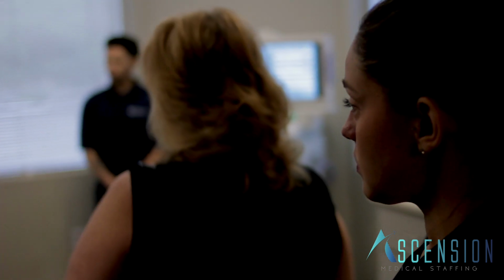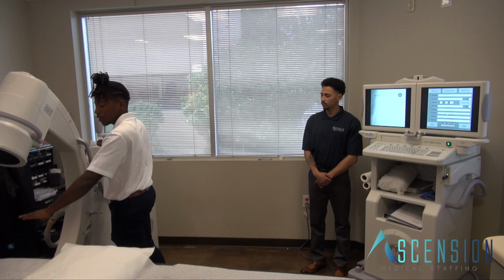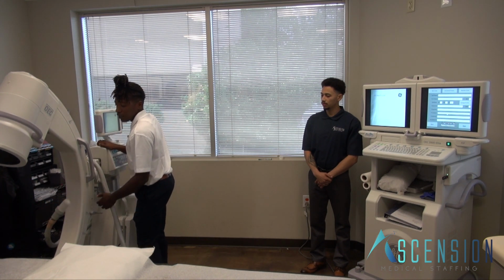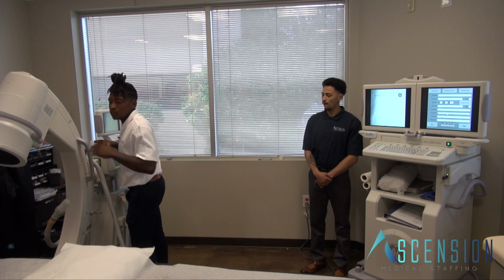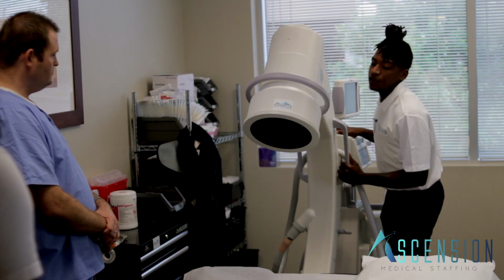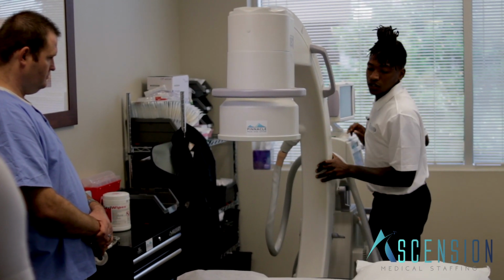From there, you have the insertion of the needle on the left side, which would be the trajectory point for the C-arm and the needle, where we're trying to land. And then your physician's going to ask you to go AP to watch contrast travel down the nerve root on down to relieve that pain.